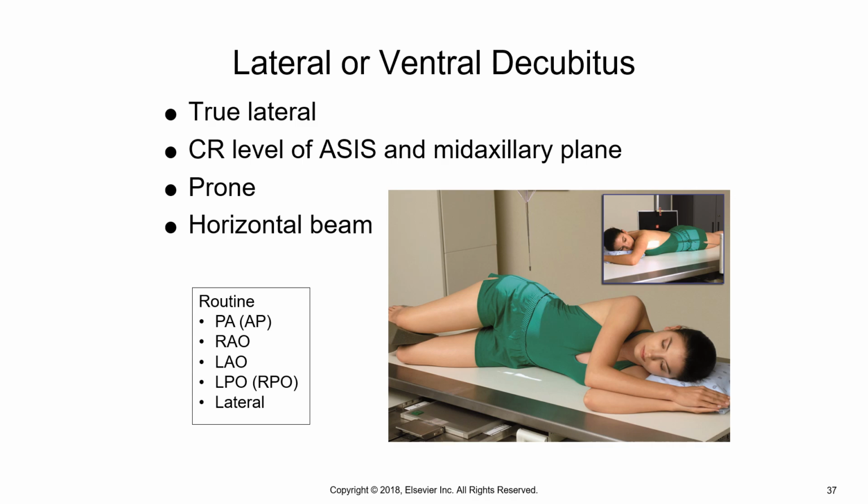This you're collimating to 10 by 12 portrait. Your technique on this, notice you're going through more of your patient and you're trying to get the rectum. So this is 110 kVp at 20 mAs for single, or 90 kVp at 20 for double or water soluble.